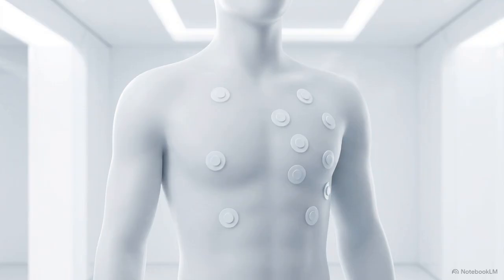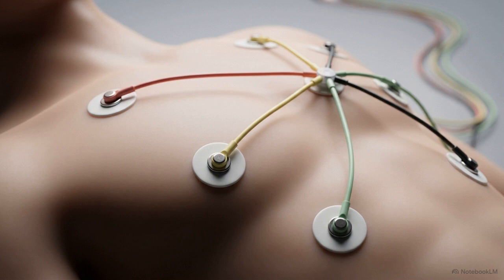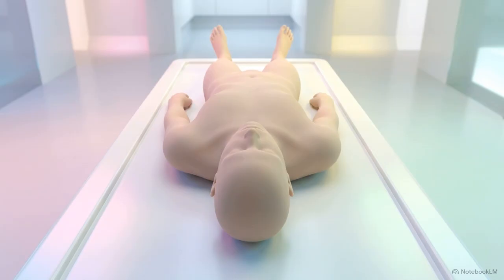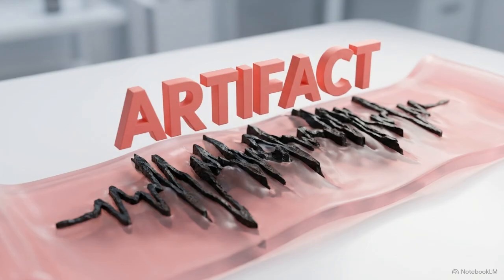To capture this data, technicians attach electrodes to specific points on the patient's chest, arms, and legs. These leads connect to the ECG machine, which records the electrical signals for several seconds. Accurate data relies on precise setup. Technicians must verify machine calibration, ensure firm electrode contact, and require the patient to remain completely still and silent, as even minor movements can introduce interference.